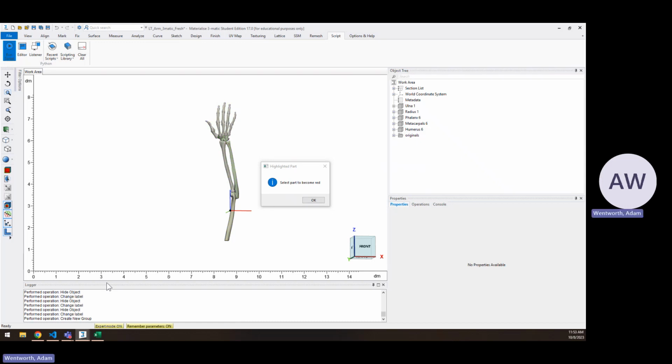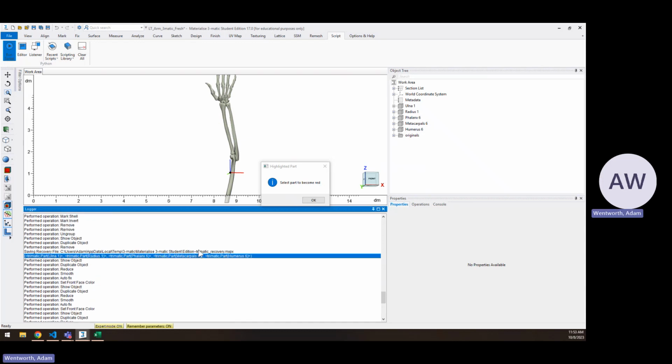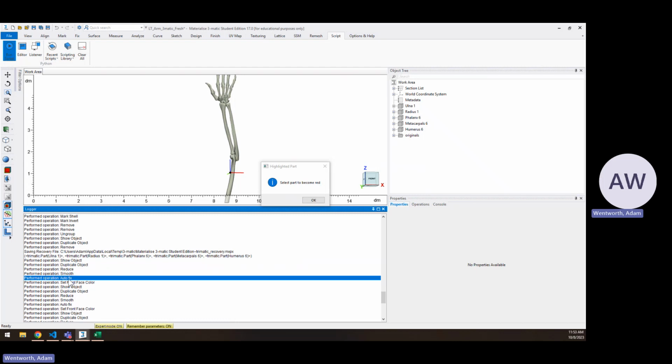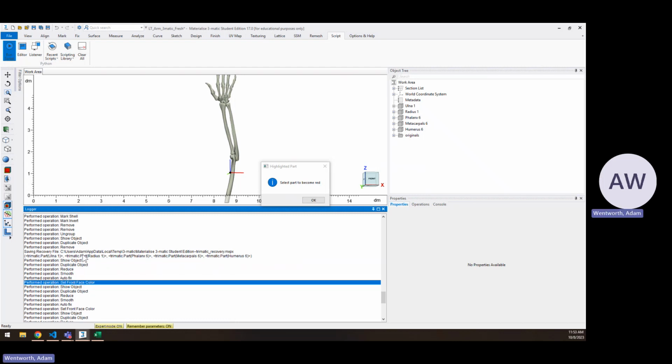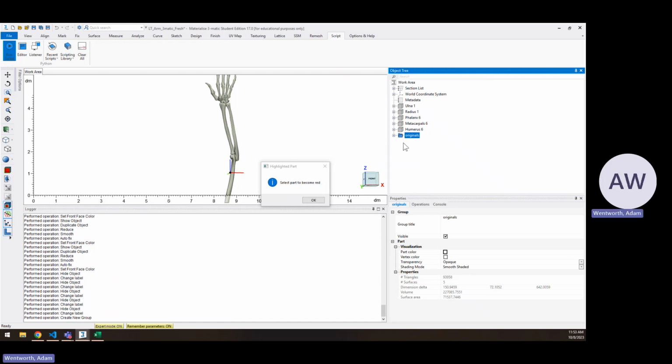Okay, so if we take a look at the logger, see all the functions that happened. So here it found all the parts and returned them, but printed them out. Then it made parts visible, duplicated, reduced, smoothed, fixed, set a color. And it did that in the loop for each of the parts that I found. So it's like 5 different parts. Okay, then it changed the label. So that find and replace did that for all the duplicate parts. So that was started here, hide, change label, hide, change label. And then it made the group of all those duplicate parts at the end, and it titled that folder originals. And all the original parts live in there, and they're also hidden.